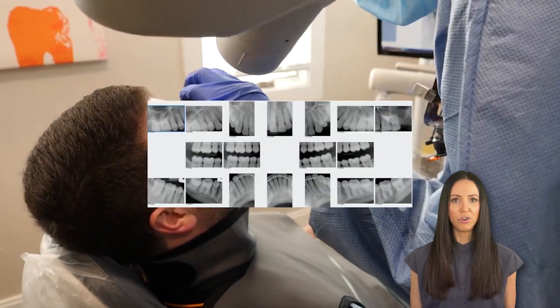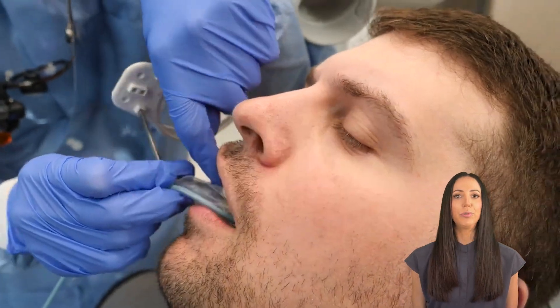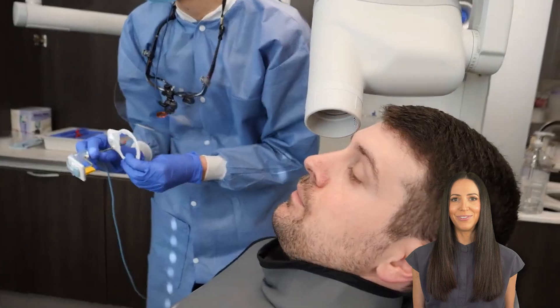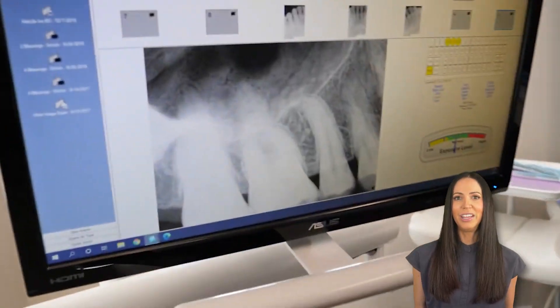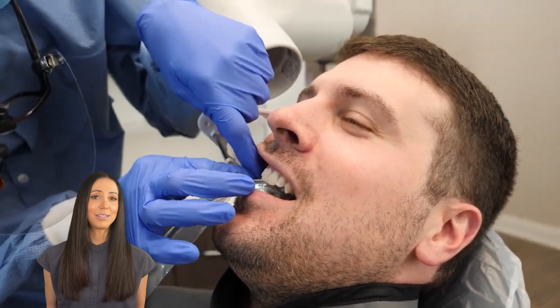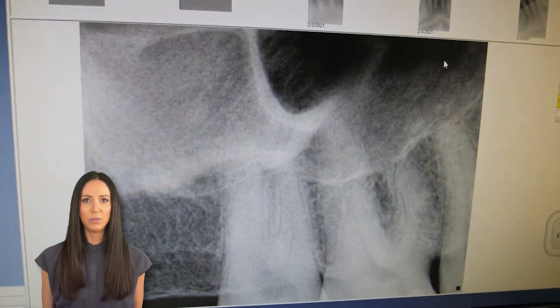You have four quadrants in your mouth: upper right, upper left, lower right, lower left — and that's what we're doing right now. We already changed out the rings to properly fit for the back teeth, and different types of holders may be used. It doesn't have to be the XCP rings like you see here — it can also be a snap array, which looks like this. Either way, most of the images taken in an FMX are PAs, the periapicals.